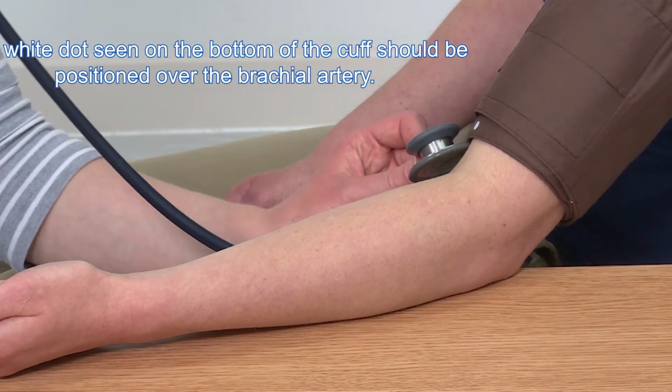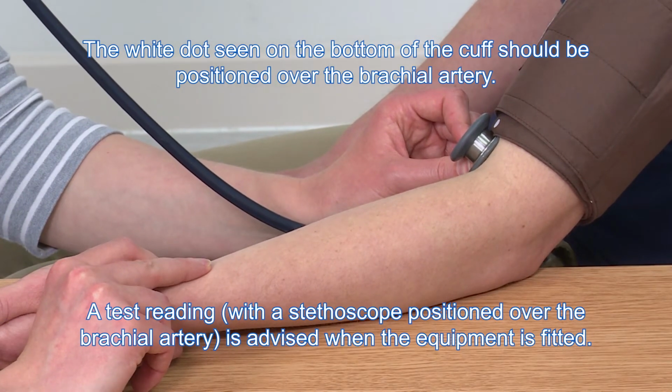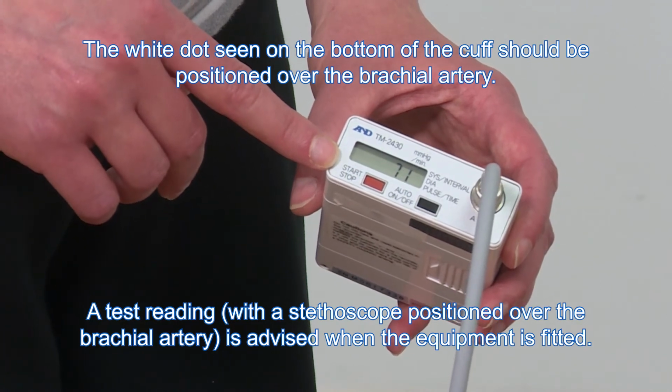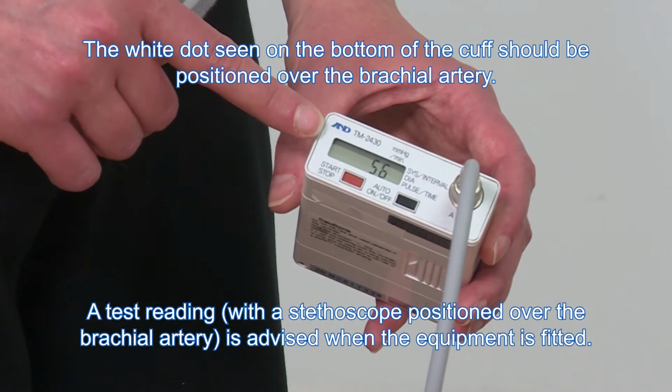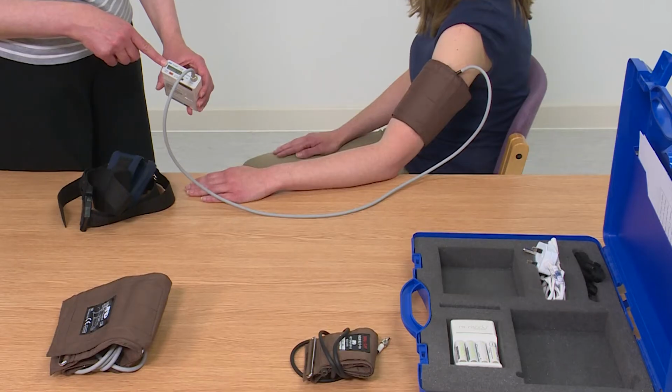Ideally, listen using a stethoscope or palpate over the brachial artery during the test reading. After the test measurement, the result will briefly display on the screen. This will only happen during the test measurement and not during subsequent readings. The time will reappear on the screen. If any adjustments are required with the cuff, this process can be repeated.